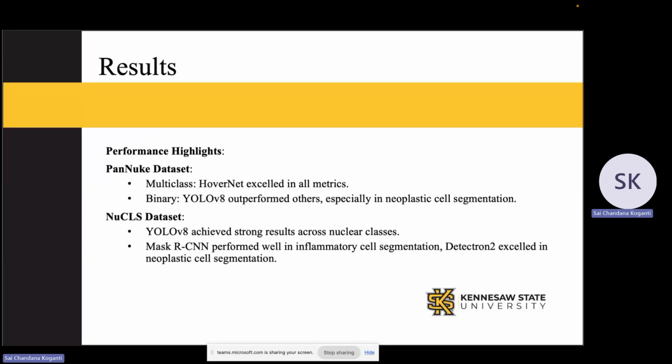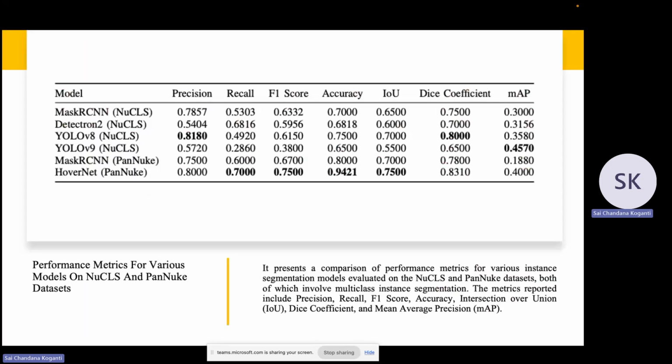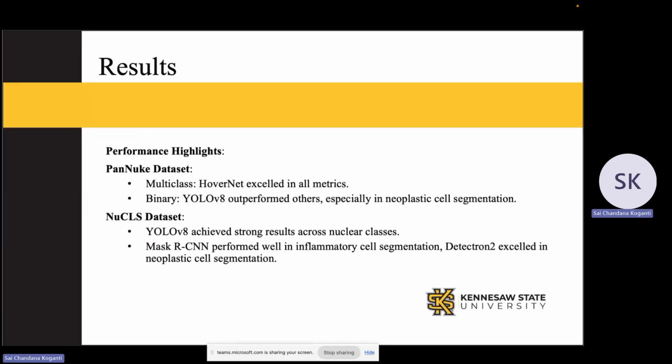So finally, in multi-class segmentation, particularly on the PanNuke dataset, HoverNet performed the best across all the metrics. You can see here I have highlighted that HoverNet performed the best across all the metrics. In binary segmentation, YOLO V8 shows the strongest results, especially for neoplastic cells.